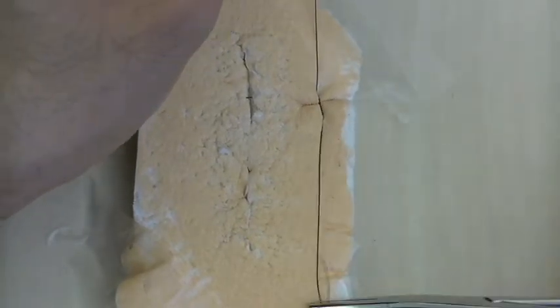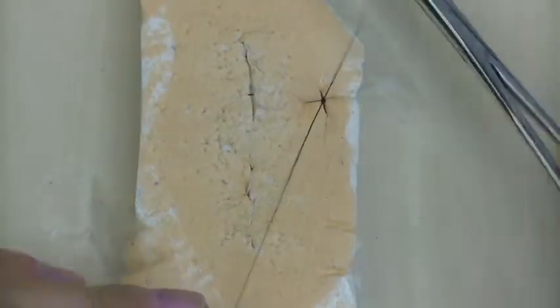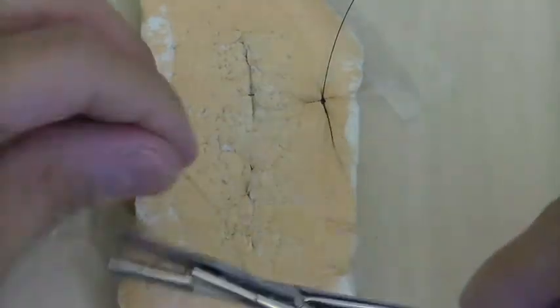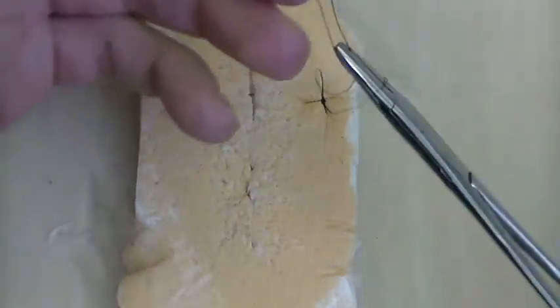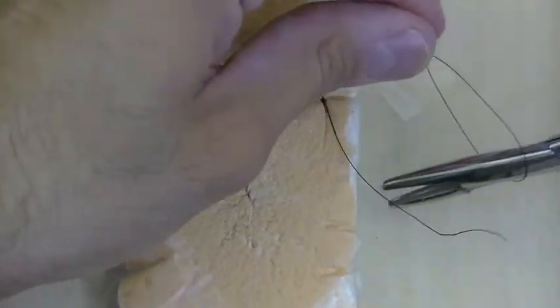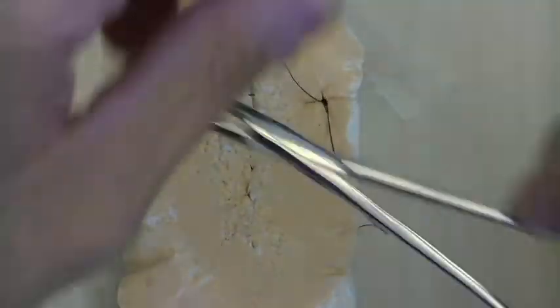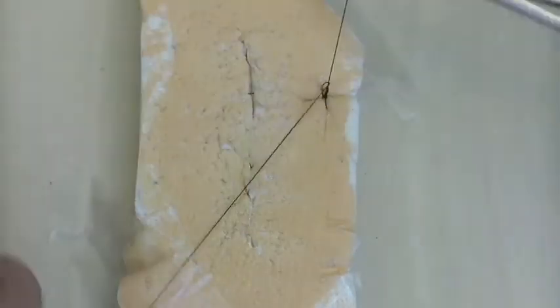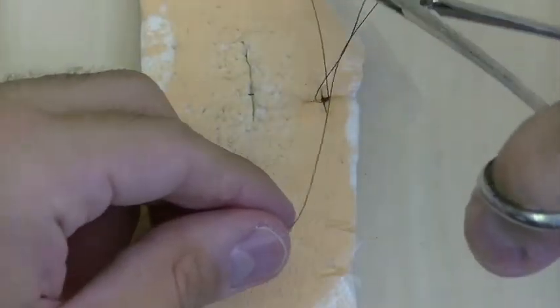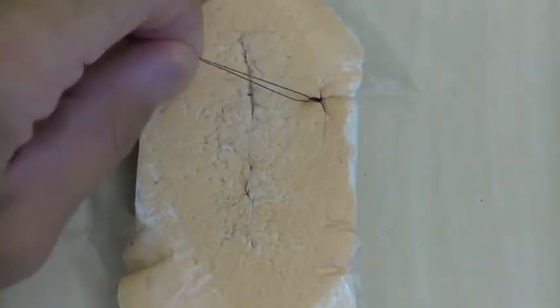You may just want to do a two-hand tie if you can, because you'll be able to get good tension on it that way, even better than instrument tying. A two-hand tie with a surgeon's knot would be the best — two knots, three, four if you're using Vicryl, or five to six if you're using monofilament like nylon or Monocryl.